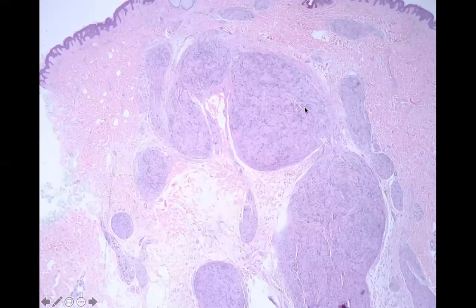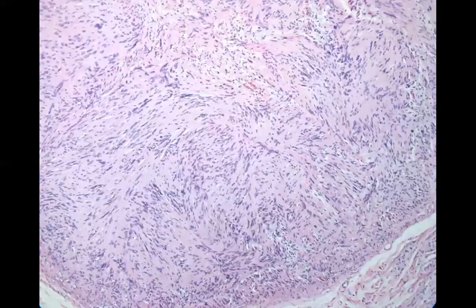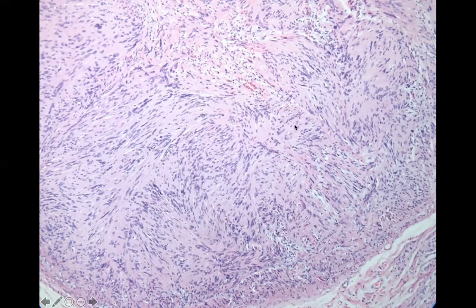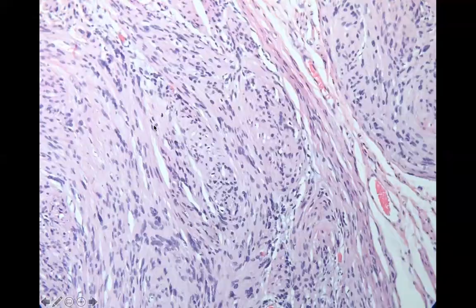Here is a multi-lobulated schwannoma, otherwise known as a plexiform schwannoma, which we can see incidentally or in neurofibromatosis type 2. Up close you can see the palisading and Verocay structures. This is also known as a neurilemmoma. It doesn't look exactly like mature nerve bundles; it has more of this palisading look of the Verocay bodies.